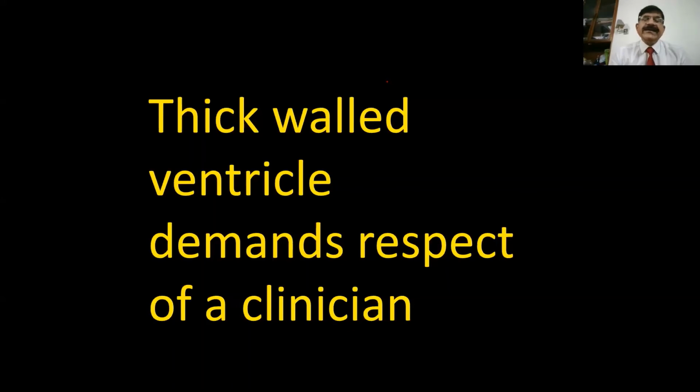With Valsalva, anything which will reduce the size of the ventricle can provoke a gradient, because you now produce a ventriculovalvular disproportion. The ventricle is small, the mitral leaflet is big, and it is now causing obstruction. That's the whole idea of provoked gradients.